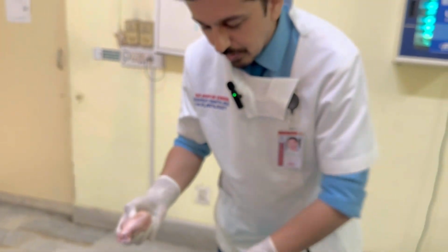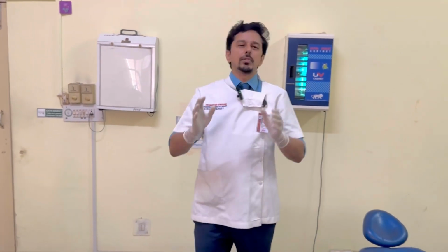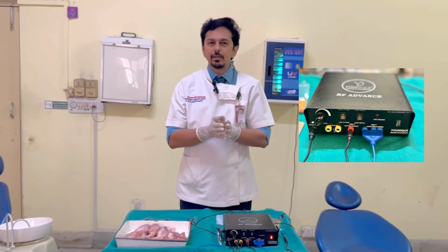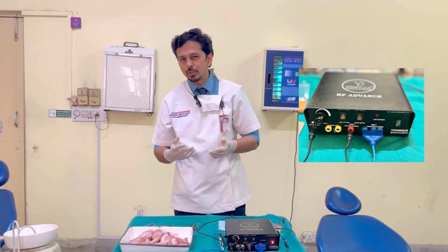So this was just a short demonstration on an animal model of the use of two modalities. Blade, if I need to access bone. Electrosurgery, whenever I need to do anything which is superficial, I don't need access to bone.